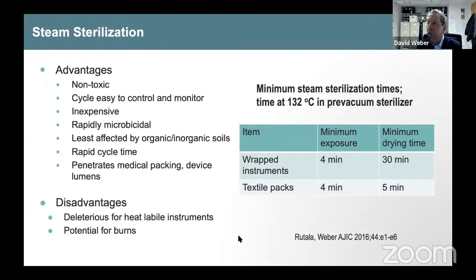The major problem is that it is deleterious for heat labile instruments, and there is some potential for burns. So if you took an instrument out of a sterilizer and immediately touched it, there could be a burn to the worker. More importantly, sometimes people use what used to be called flash sterilization, and take a device out and put it directly on a patient if it's not cooled, usually in sterile saline or water. We have had patients have burns.